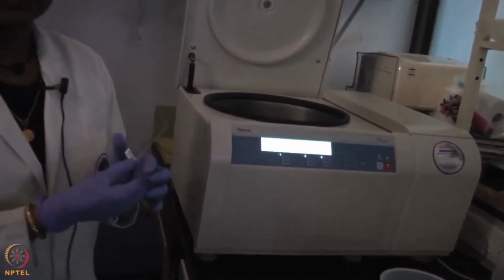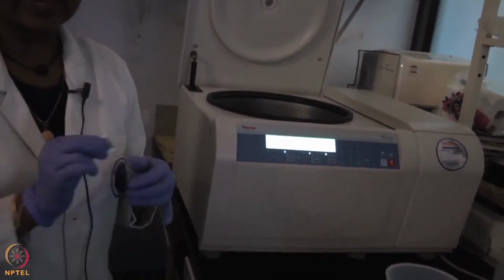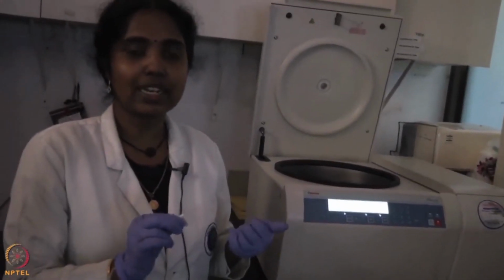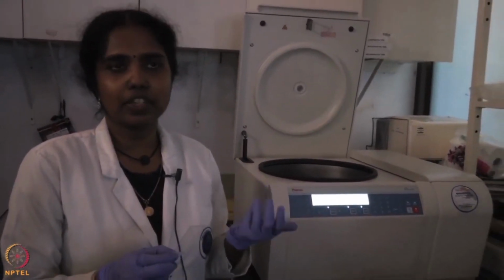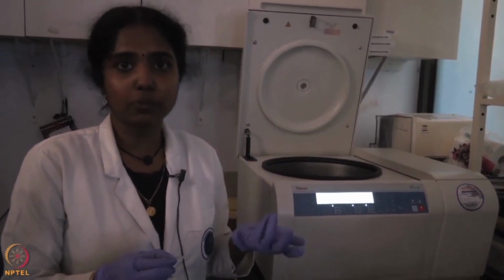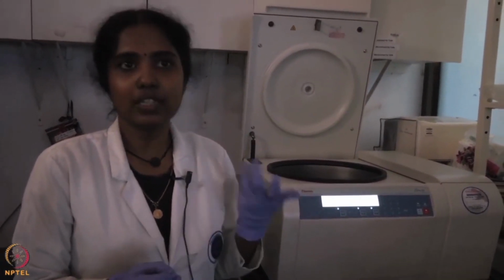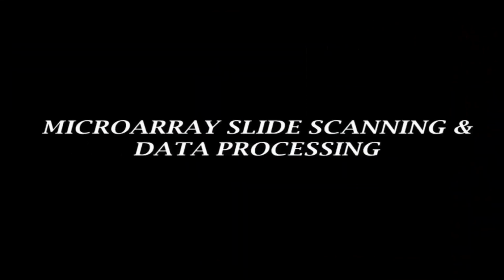After complete drying, now we have to scan the slides in 2 different wavelengths. One is 635, which is for the red channel, and the 532 for the green channel. So the 635 red channel will show the anti-human IgG, that is the autoantibodies in patient sera, and Cy3, that is the green channel, which is a QC check. It will show all the printed protein spots.